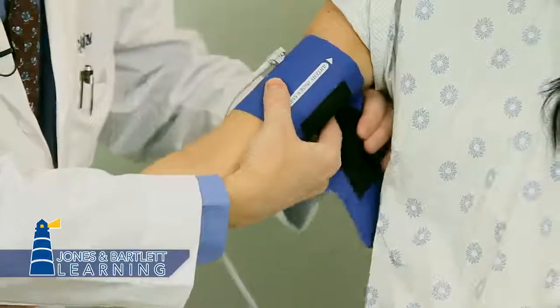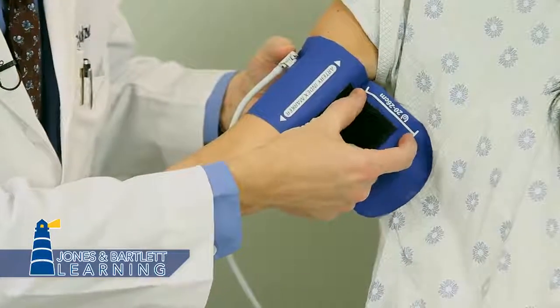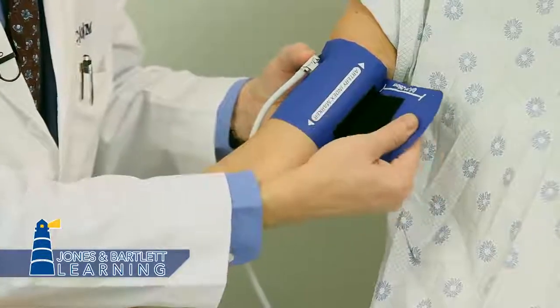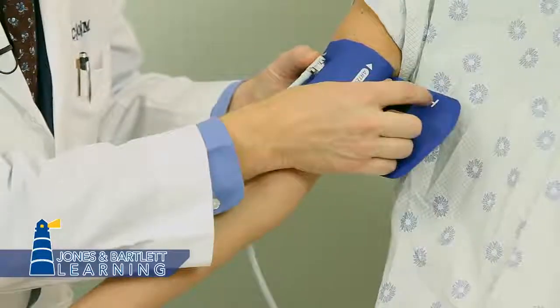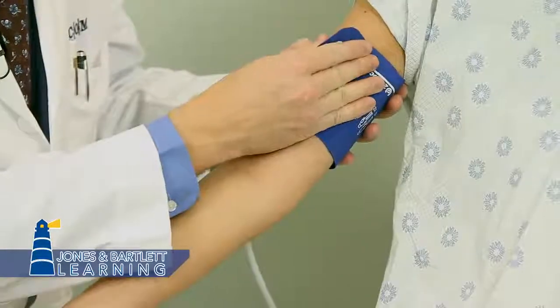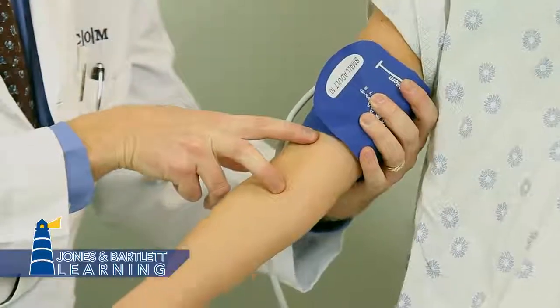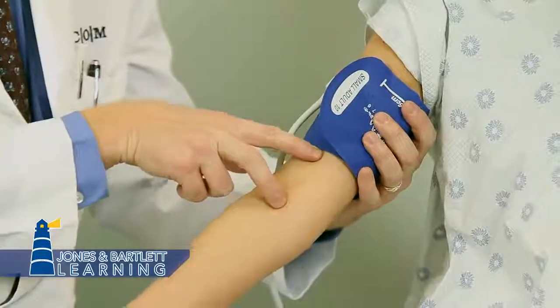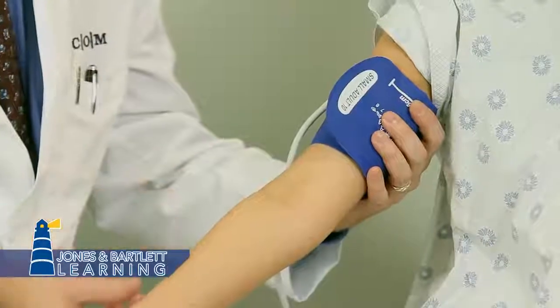And then you wrap the cuff around, and you see this range marker on the inside. The little cuffs will be different, but in this case, it has the marker right here, the index, and as that wraps around, the artery marker should fall within the range. In this case, it does. So once that's in place, you're making sure that you allow at least 2 centimeters. This is nice, we have a long upper arm so we can give as much area as possible for our stethoscope head to be placed here.